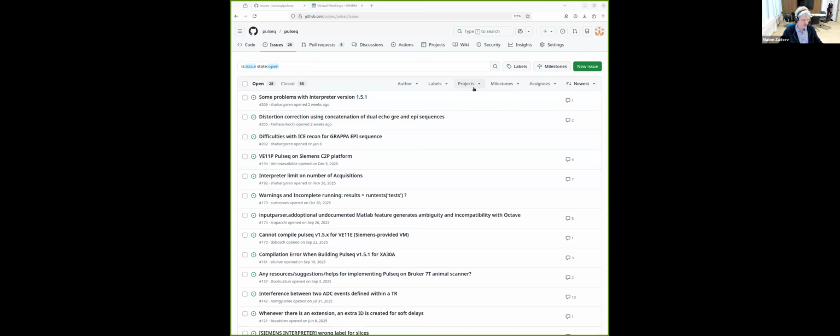Apparently some other situations also produce this. Maybe the shape memory is not properly released, but we don't know. We don't really see any meaningful log entries, and I tried to ask Siemens people several times. Nobody knows what's happening. This is a little bit unfortunate, but once again, if you've learned to reproduce the problem, preferably with the new interpreter, which you don't have yet, please let us know.